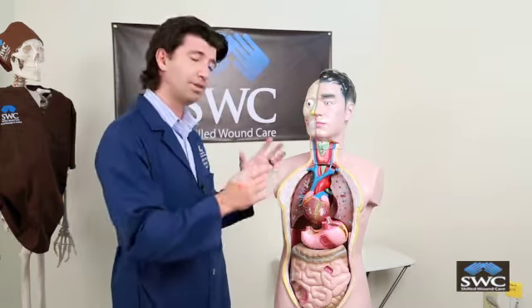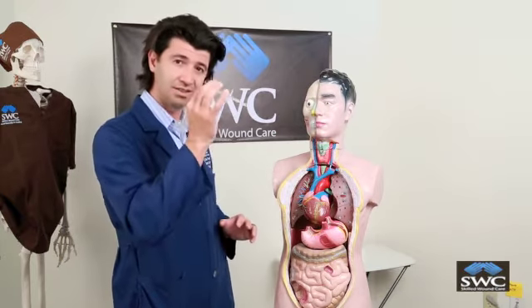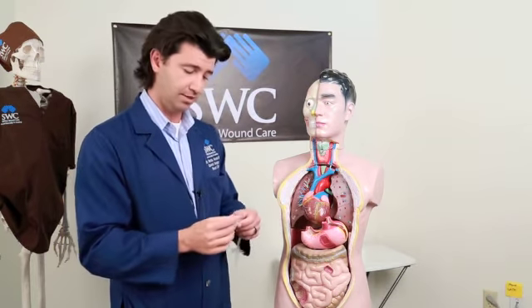If you have a patient that pulls a gastrostomy tube, it's best that you call our services to come in and change those tubes for you. If the patient has the tube pulled and we can't get there right away, make sure to place the patient on IV fluids, place a temporary Foley catheter in the tract to keep the tract patent. These tracts close within 2 hours until our services can arrive and change the tube for you. If the patient is a diabetic, make sure that you are also giving the patient sugar water. Now, that's our review for gastrostomy tubes.